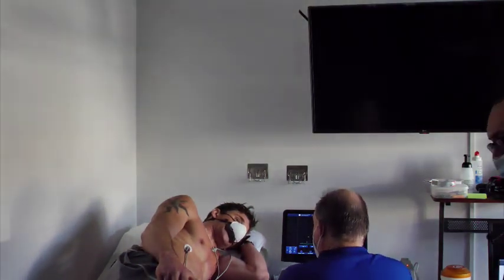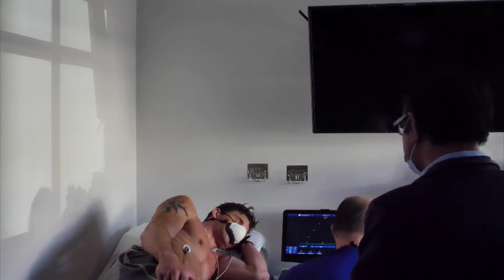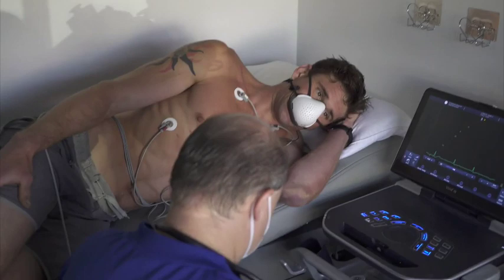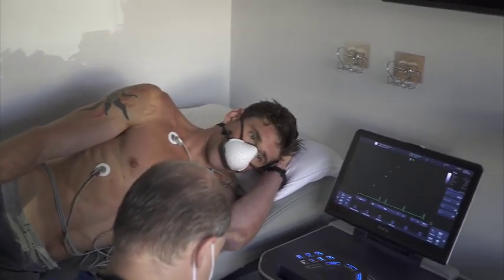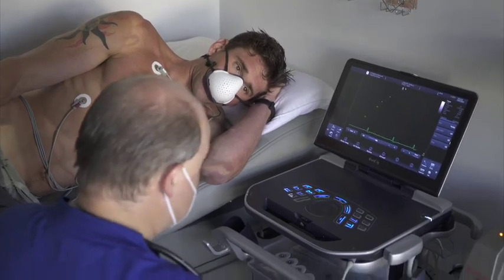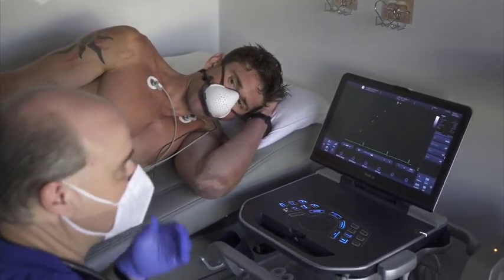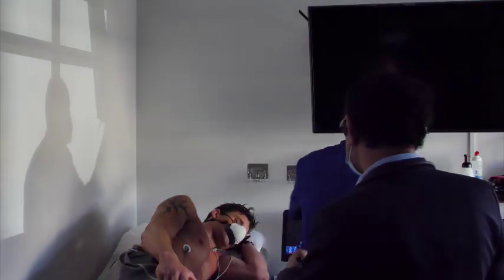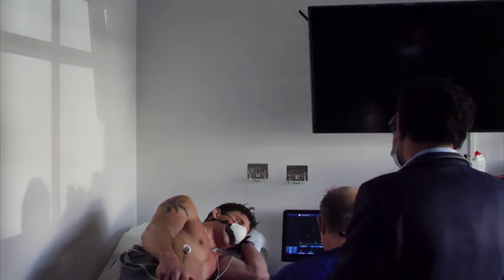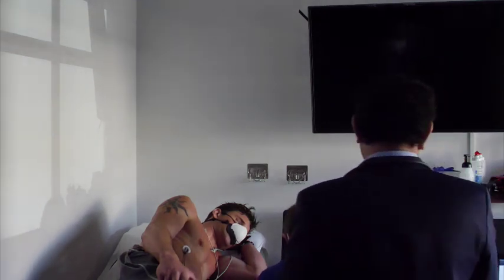My mom always told me I had a big heart — we'll find out. All of the measurements will be normalized to your body mass index, and we can get the body surface area calculation. I'm six foot two and 181 pounds.